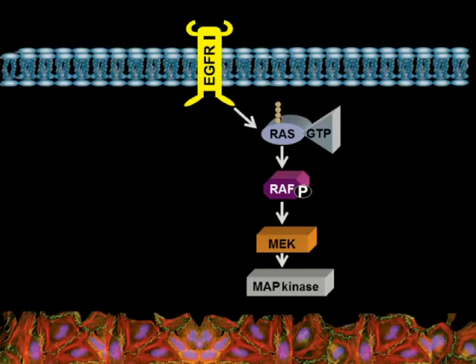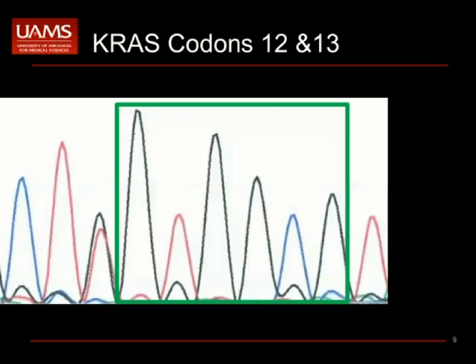If it's a reasonably consistent, small, and reproducible region, it's a lot different than the scenario of a larger region, such as exons that need to be analyzed, because if you have a very targeted area like a BRAF mutation, you can apply something like pyrosequencing, which only sequences a very short distance from the primer site, as opposed to a gene that might have mutations spanning across multiple exons, where you really need to look at the entire exon in order to detect these random mutations or more random mutations.